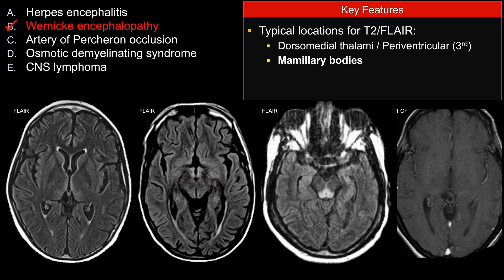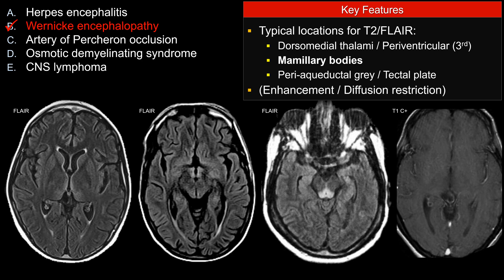The differential diagnosis is quite short. Another location is around the tectal plate or by the periaqueductal gray. Often there's enhancement and restricted diffusion associated with this area. In this particular case, we don't really see that much enhancement — there's just a thin enhancement around the lateral edge of the thalamus.